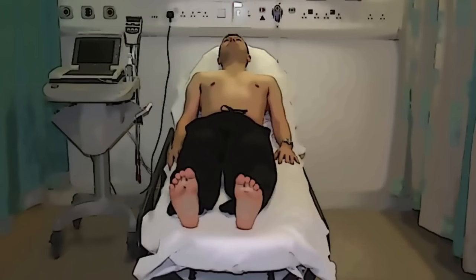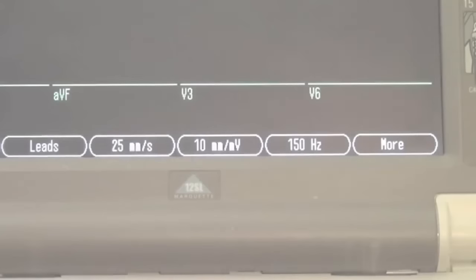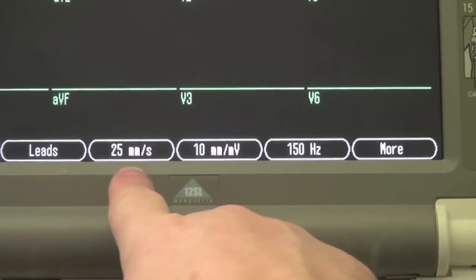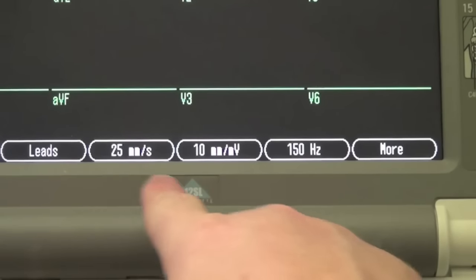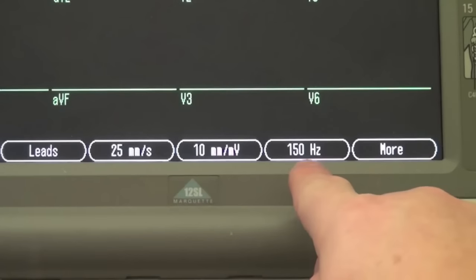Unusually for a medical procedure, we should do an ECG from the patient's left side where possible so that we don't have to lean over the patient. Check that the machine is set up correctly. The paper speed should be 25mm per second, the gain at 10mm per millivolt, and the filter at 150Hz for a standard ECG.